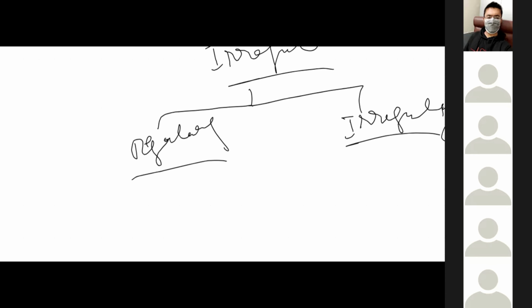We can say it is sort of isoelectric, not exactly isoelectric, but if you see the RS ratio, it will be neither more positive nor more negative if you cross check it. So this will be the normal lead 3.